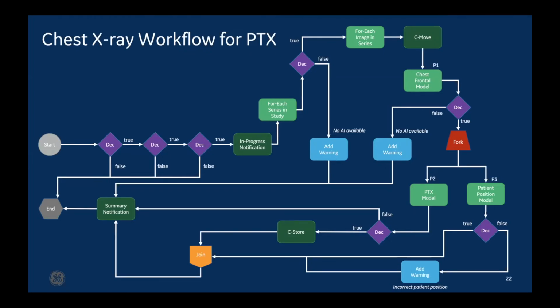But the question now is, how do I make this thing work? What are the steps I need to make this work end to end? Here's the workflow for the pneumothorax. We call this PTX. It starts with some basic decisions.